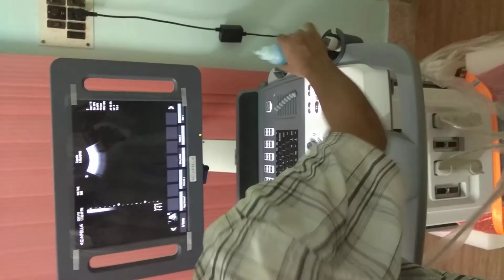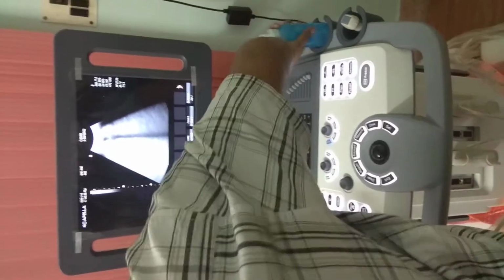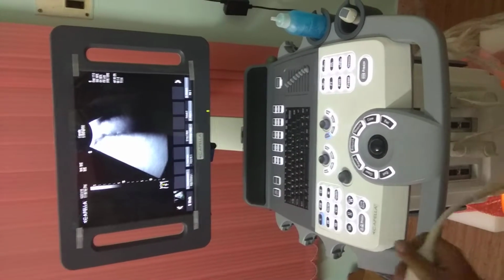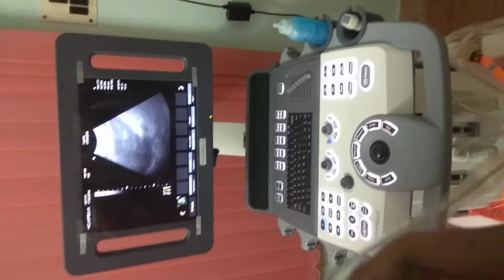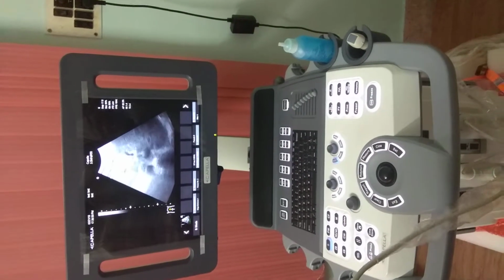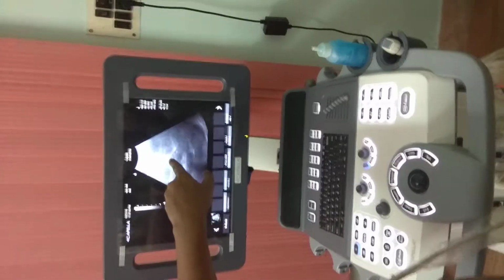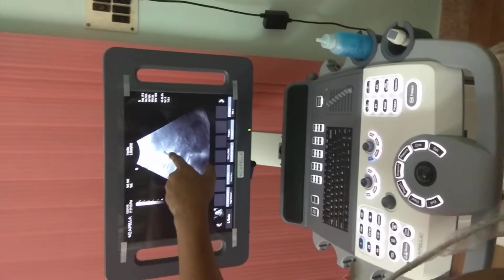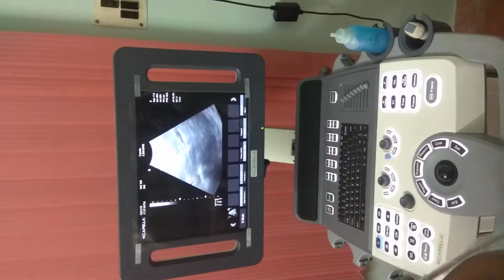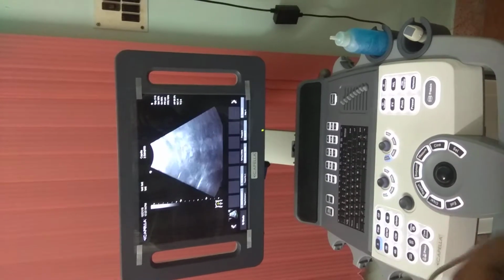Let's see some color flow movements as well. I think we can just find out the stomach and we can see the color flow mapping and PDI and everything. So yes, you can see the pancreas over here. Or you can see this.